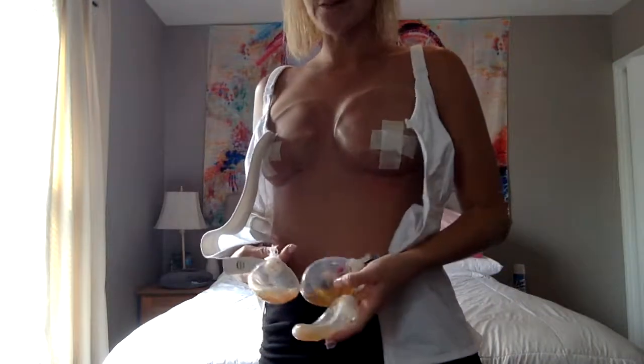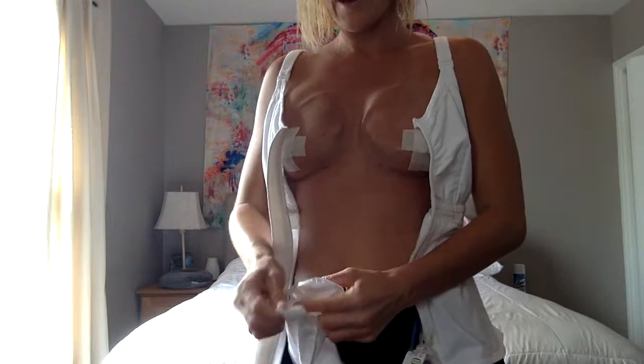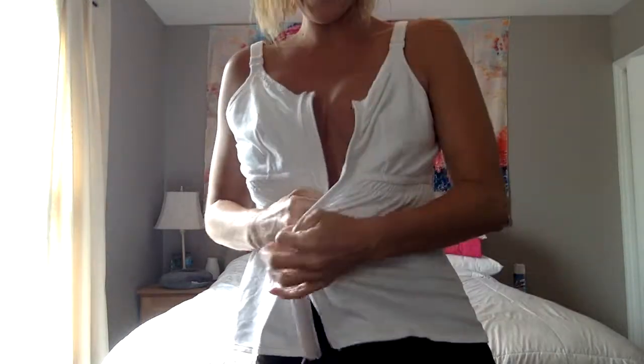You know, there are so many ideas that you can do. I actually looked up a DIY on YouTube for how to make a bag for my drains because this vest was uncomfortable. And for me, the lanyard hanging here, even though everything is completely numb right here, is still almost a little irritating. So now my drains are just hanging. What they do is give you a little baggie like so to put it in. And then you attach it here, put it in the baggie, zip it up.